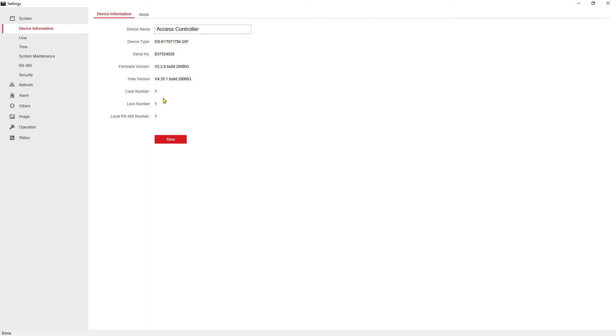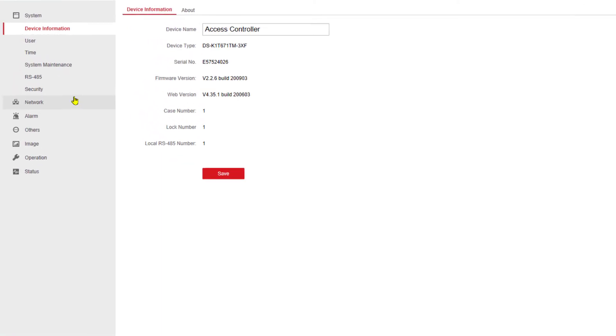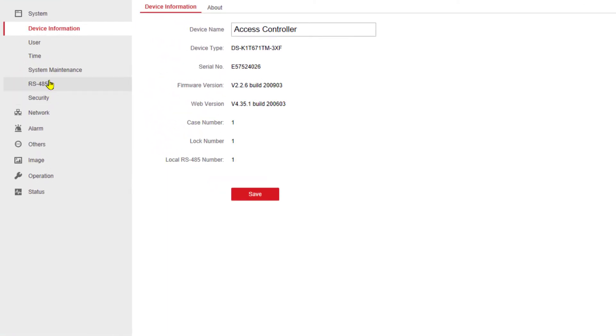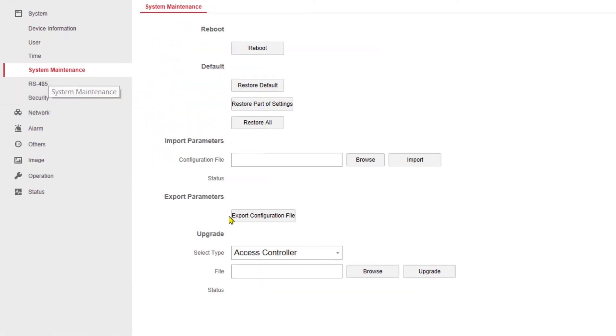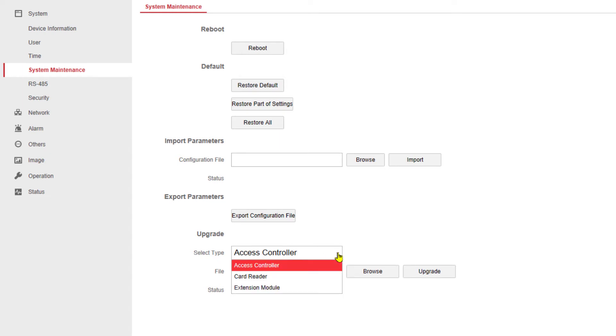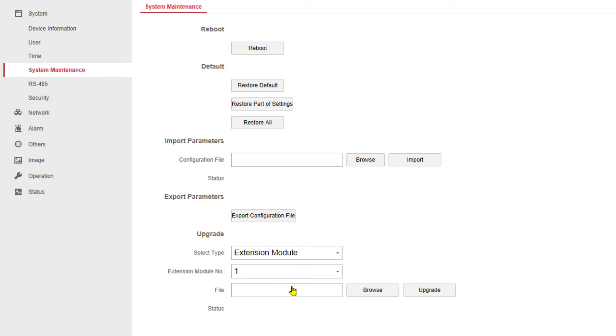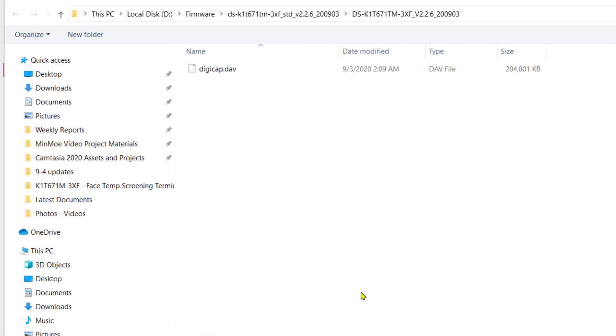This will open your remote configuration window again. You can go back to system maintenance, and in this case, the next item that we want to upgrade according to the PDF is the extension module. So I've got extension module selected, module number one, because I only have one controller, so my controller is number one at this point, and I'm going to click on browse.